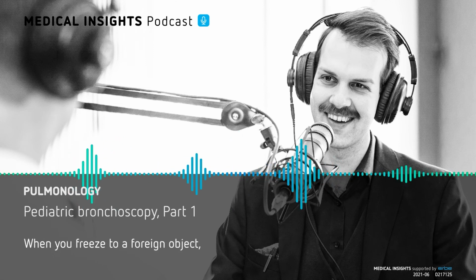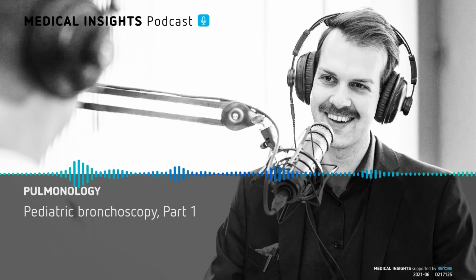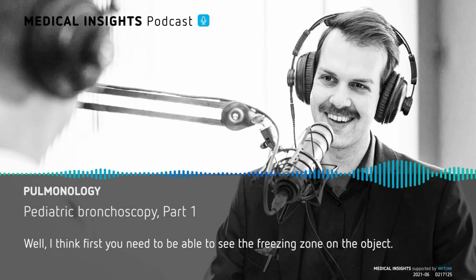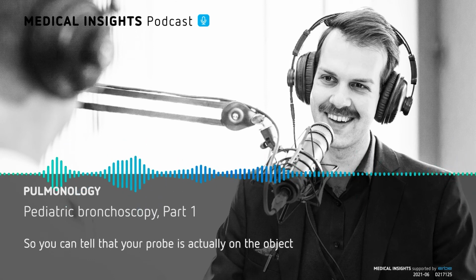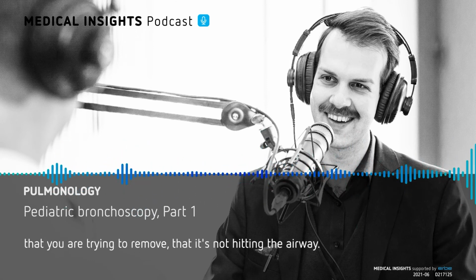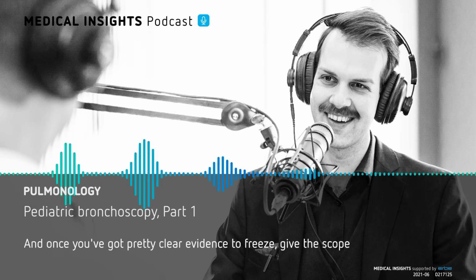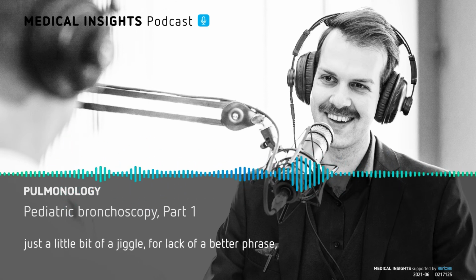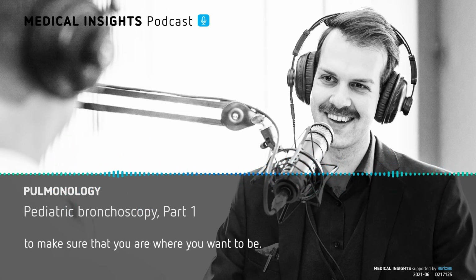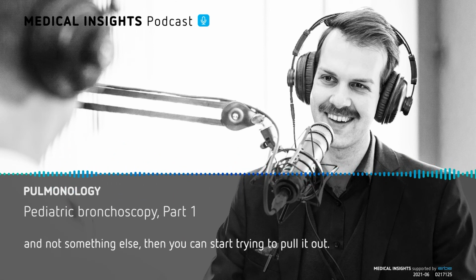When you freeze to a foreign object, when's the point you decide to start pulling it out? What's the sign you're waiting for to pull? Well, I think first you need to be able to see the freezing zone on the object. So you can tell that your probe is actually on the object that you are trying to remove, that it's not hitting the airway. And once you've got pretty clear evidence of freeze, give the scope and the object a little bit of a jiggle, for lack of a better phrase, to make sure that you are where you want to be. And then once you have pretty well confirmed that you're attached to the object that you want and not something else, then you can start trying to pull it out.